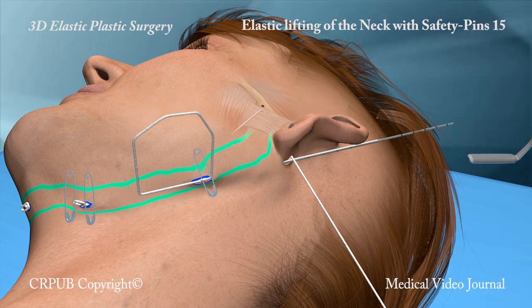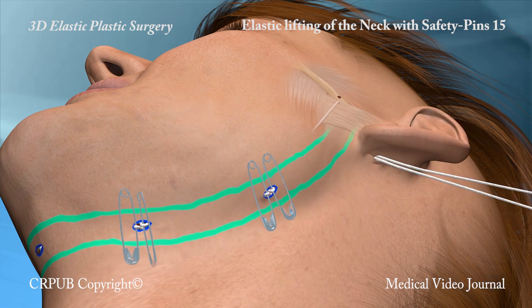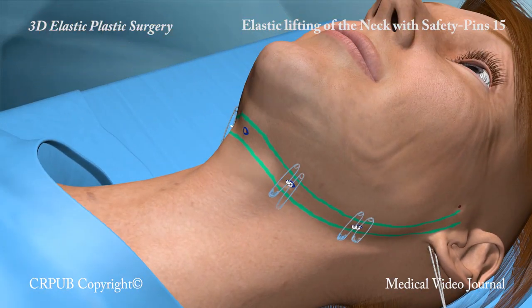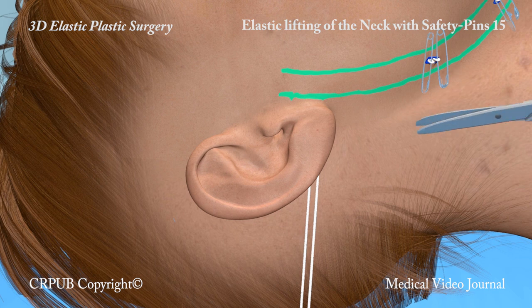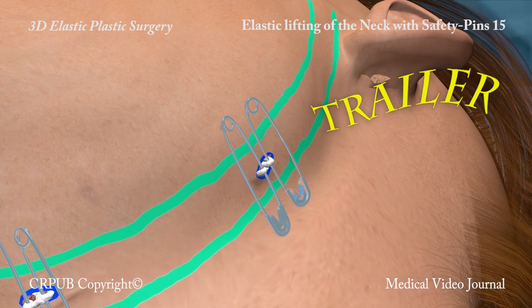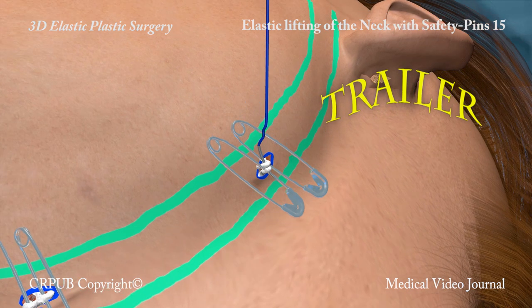The elastic threads on both sides are placed firmly under tension and knotted. The two parallel elastic threads, which have been kept out of the small incisions by the safety pins, are sutured together with a 5-0 polyester thread. Fixing the two elastic threads together prevents the skin from sliding downwards and forwards over time and recreating a skin fold.